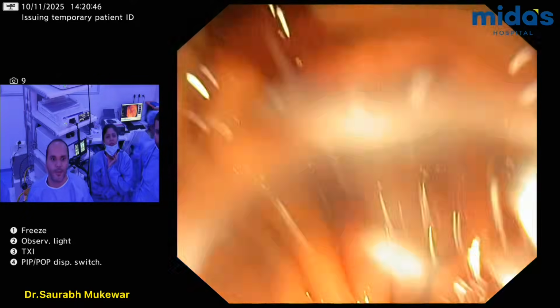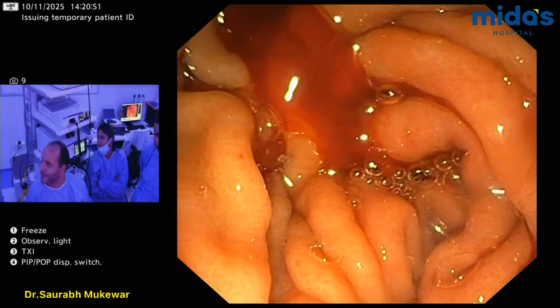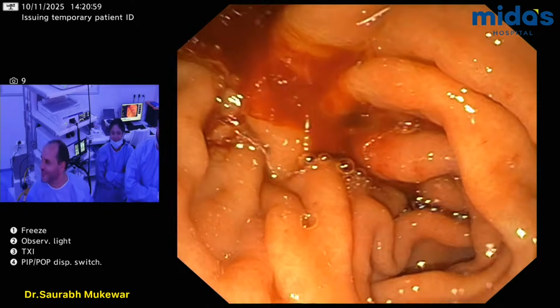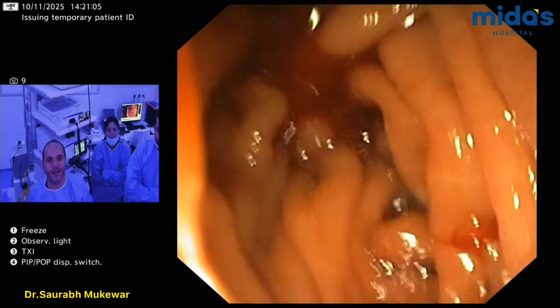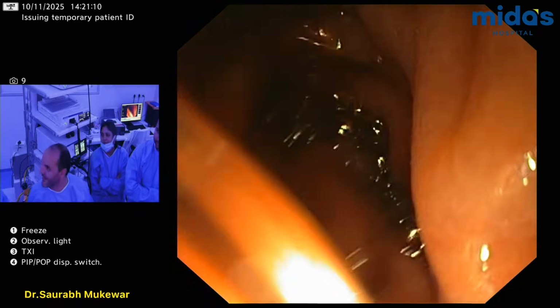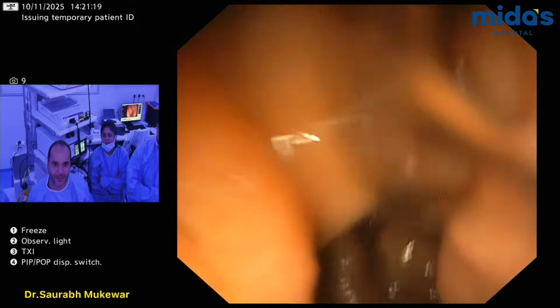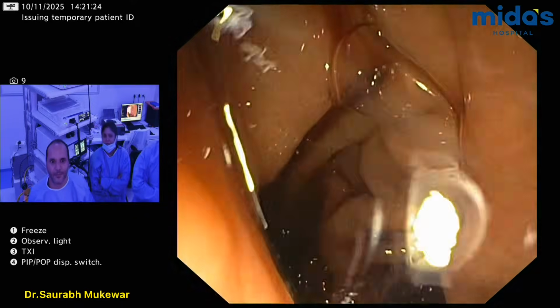It's okay, it'll ooze, don't worry. What happens when there's a biopsy with endoscopy and there's blood, do you put a hemospray on that? It's okay, there'll be some blood. I'm just kidding. The point I'm trying to make is you do a biopsy, there is a little bit of blood that flows, it stops. Same thing with the EUS. There's a bit of blood, it'll stop. But obviously, if it's pulsatile and spurting and the whole screen is red, it'd still be okay for the most part, but yeah. Go, push, go.